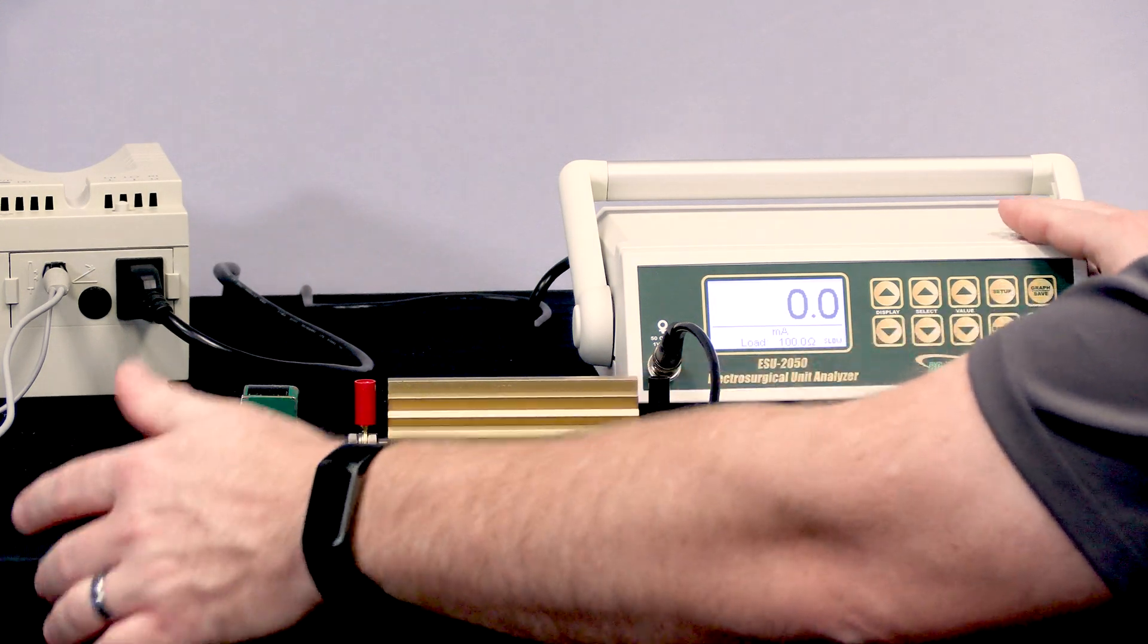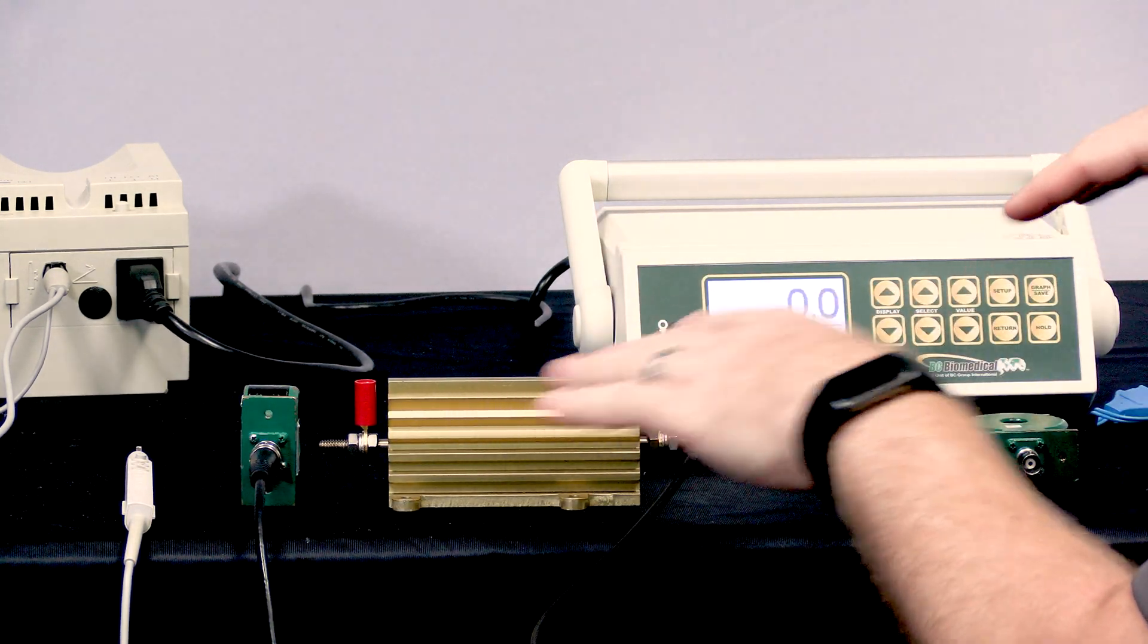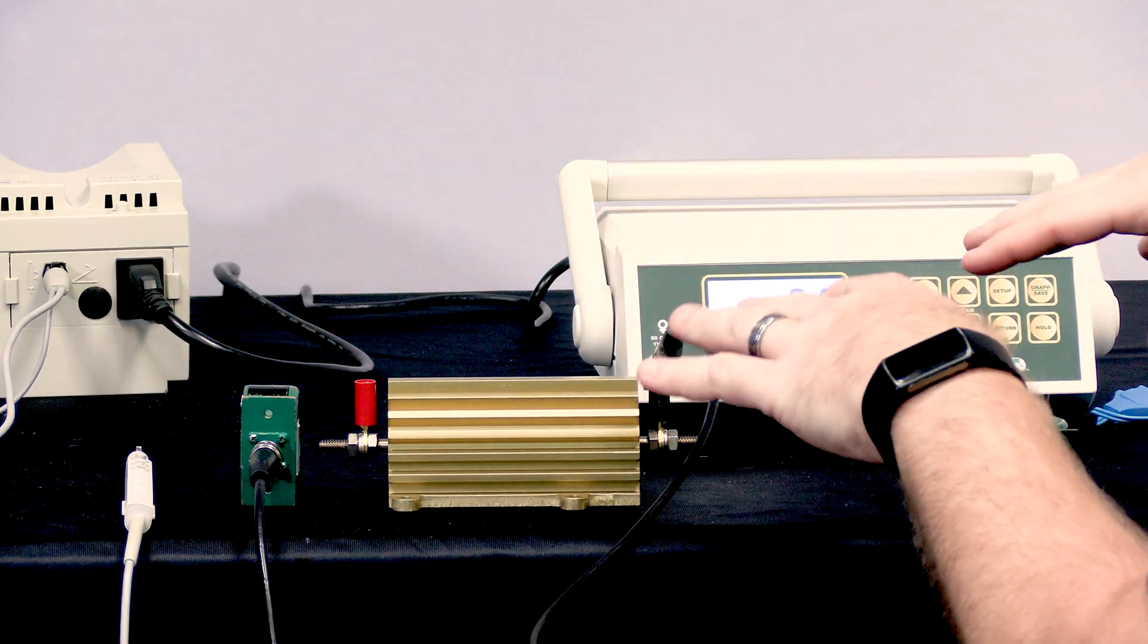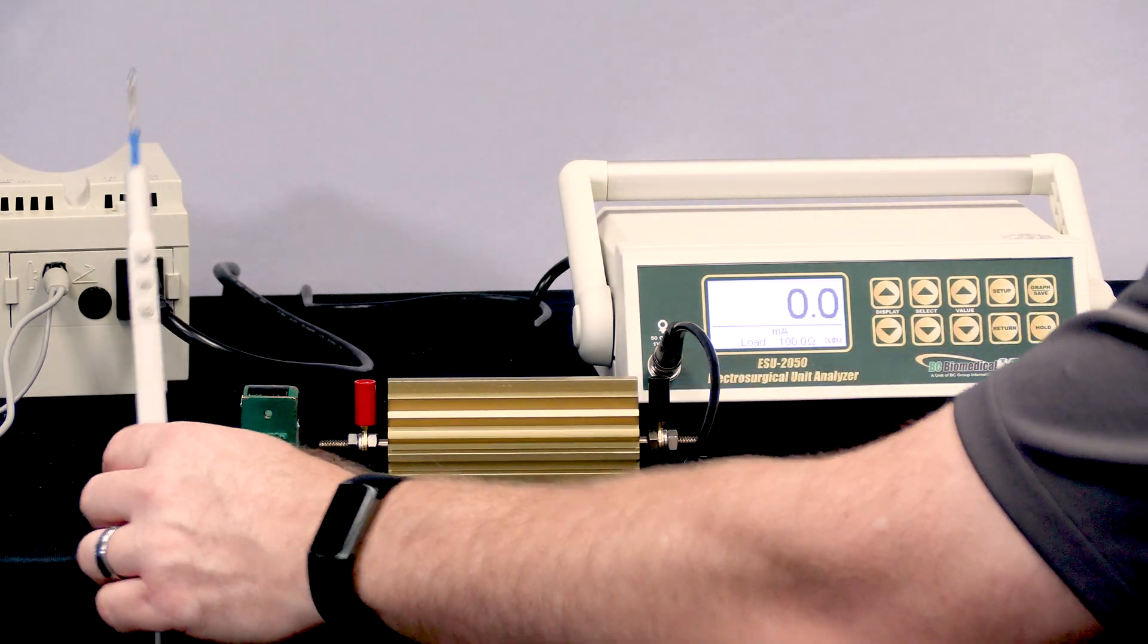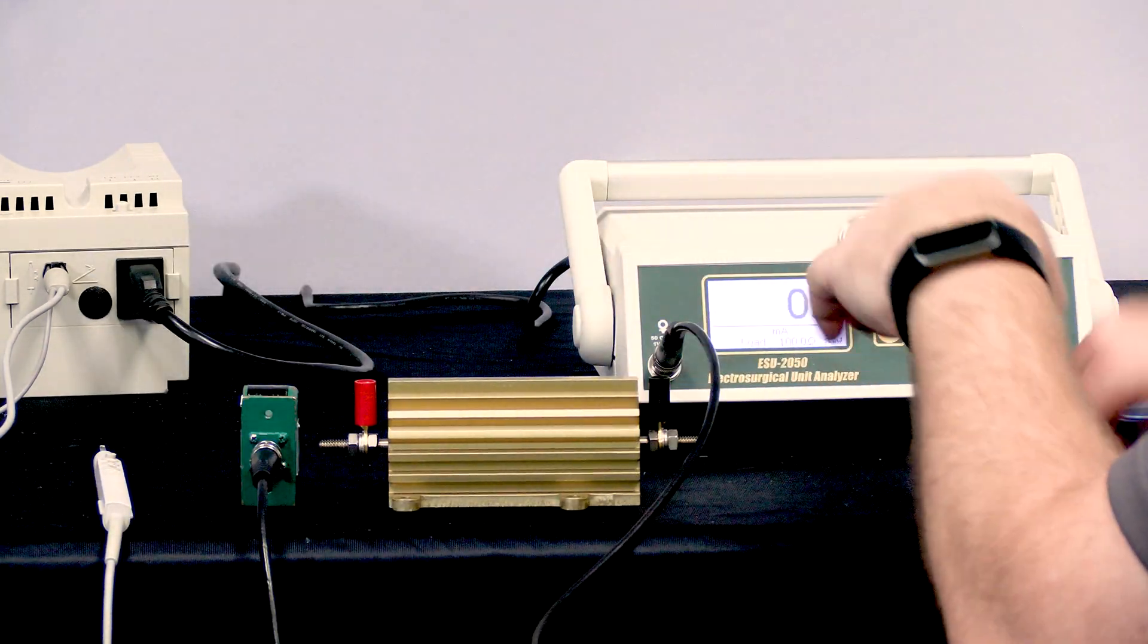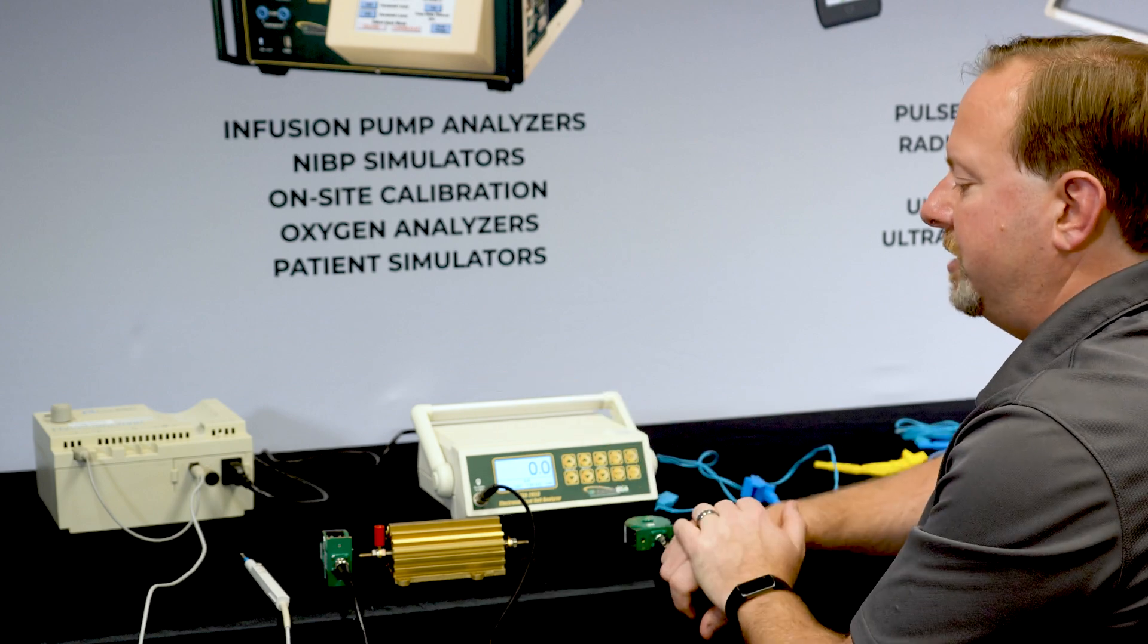So in surgery, it actually uses the table that the patient is laying on, which is connected to earth ground. The circuit path is out the scalpel, through the patient, to the table, back to earth ground, and back to the generator.